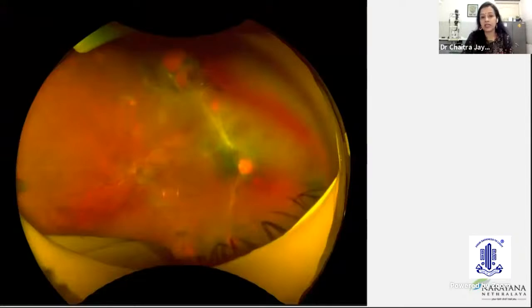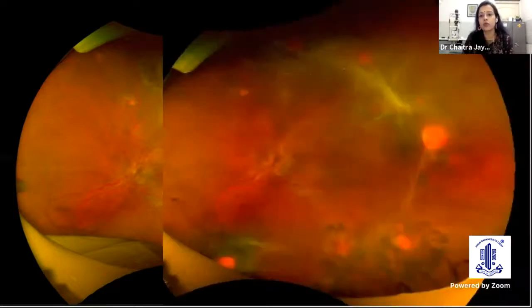Tumors, extent, severity. This is a young boy who's already lost one eye. He has VHL. You can see the number of angiomas. We literally counted about 12. Some of them previously treated. Now, unfortunately, he has developed a TRD, has undergone surgery, and brachytherapy, and is doing quite well. This is his only eye.